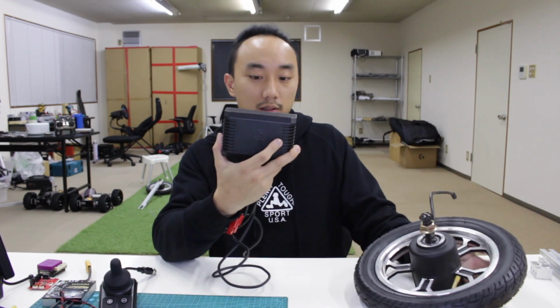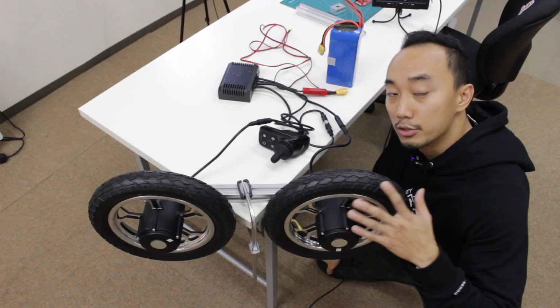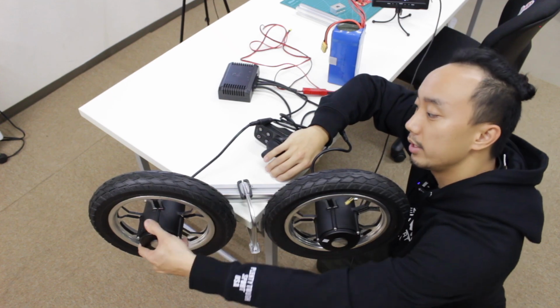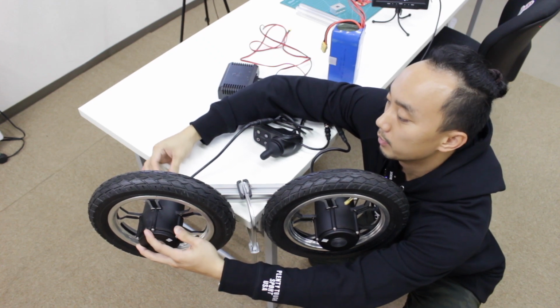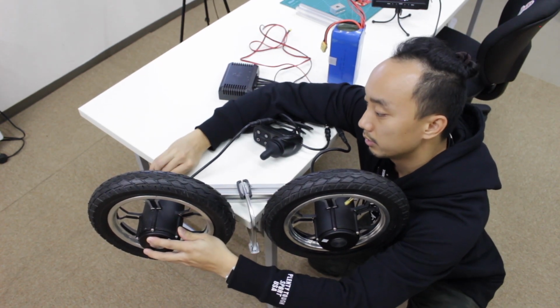So it comes with two of these motors, one ESC and one joystick. On the ESC, you will see there are two cables that need to be plugged into the wheels, one for the joystick and one for the battery. This is the default setup for the wheelchair. You can see the battery isn't plugged in, so the wheel can turn freely by itself. But if I enable the brake by releasing this screw, we can see that it locks, and I can make it turn freely again by tightening this screw like this.